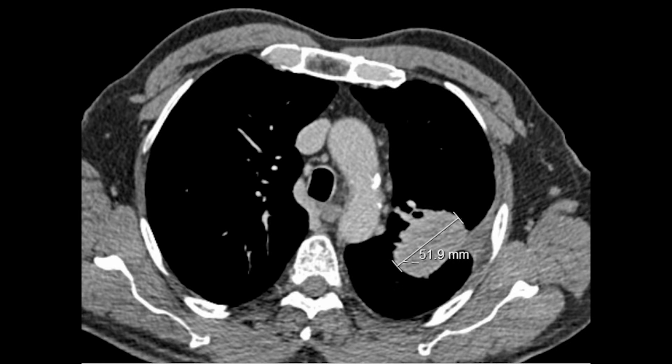It's also not always straightforward which measurement you should take. You should look at the lesion in advance and try and predict where the measurement you're taking is going to change as the lesion shrinks or increases in size. So ideally you should take the largest measurement you can, but particularly pick the margins that you think will still be identifiable as the lesion changes in size. And here's an example. In this simple example, the boundaries of this lesion can reasonably be expected to be identified regardless of whether the lesion increases or decreases in size.